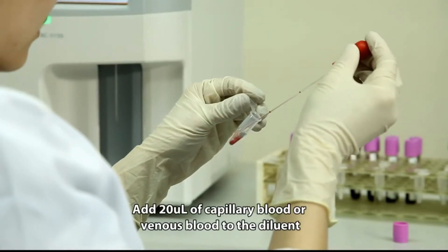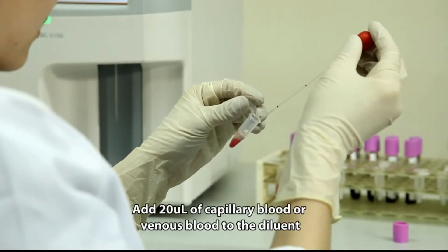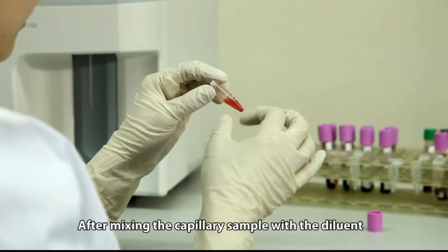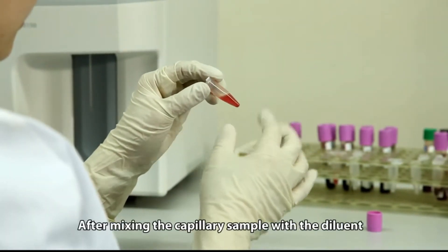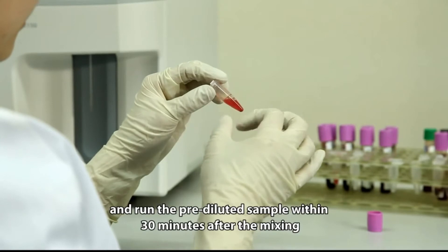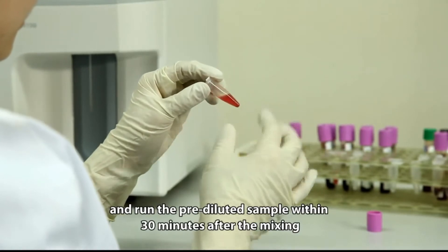Add 20 microliters of capillary blood or venous blood to the diluent. Close the tube cap and mix it properly. After mixing the capillary sample with the diluent, be sure to wait 5 minutes and then remix before running the sample. Run the pre-diluted sample within 30 minutes after mixing.